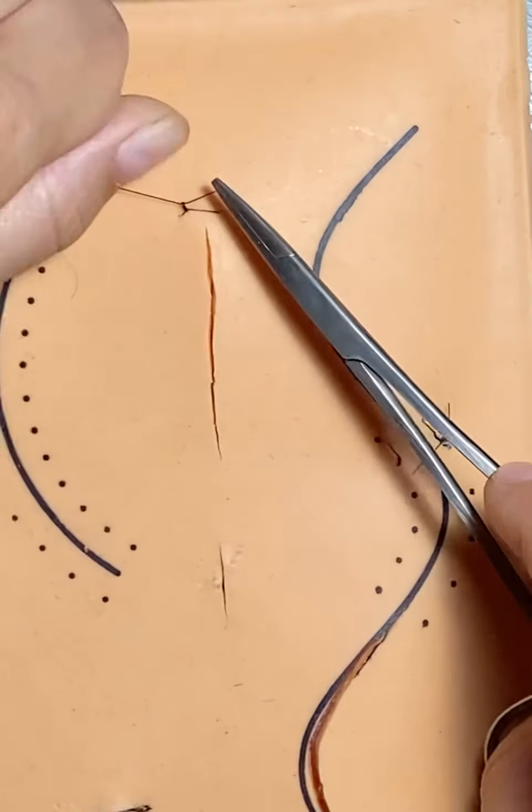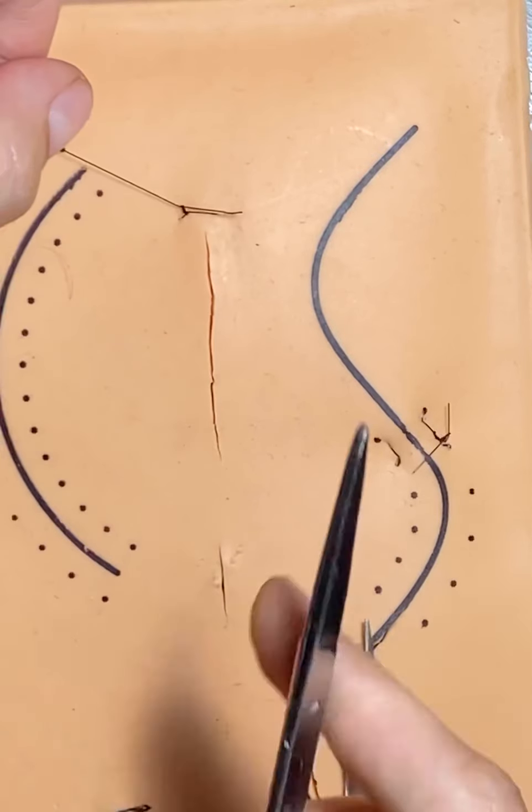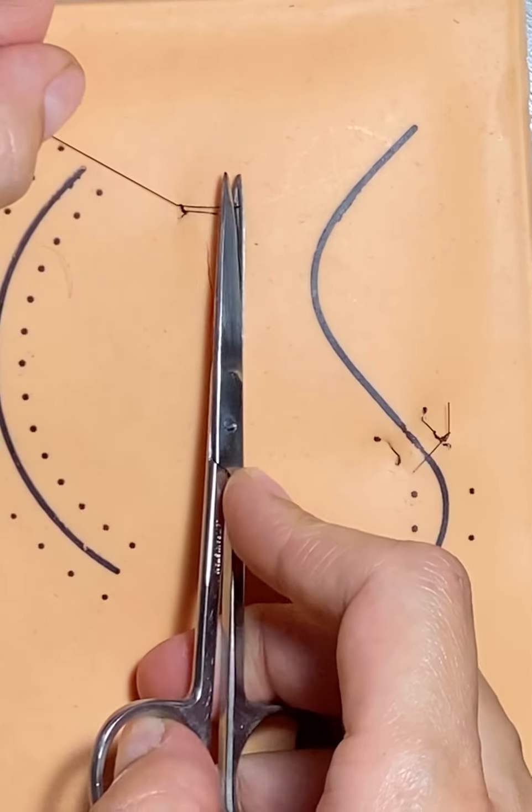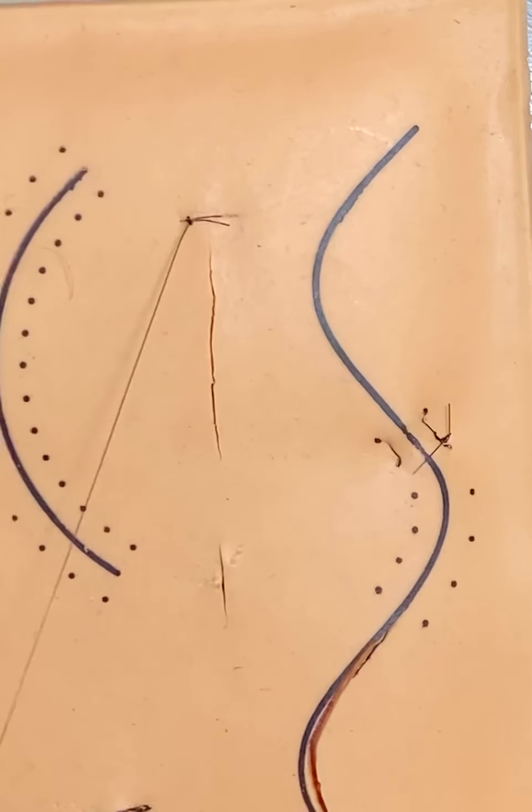So there's six. You can do as many as you want. We'll cut that a little bit. And you're just cutting the one tail, leaving the rest of your suture attached to your needle.